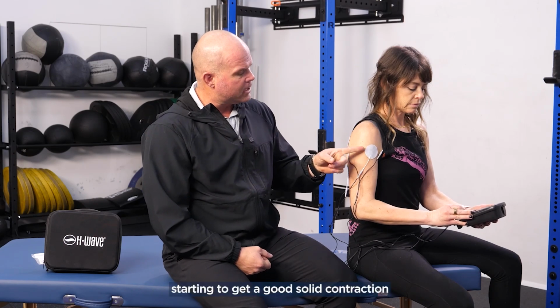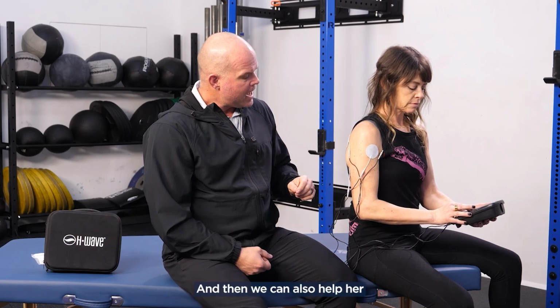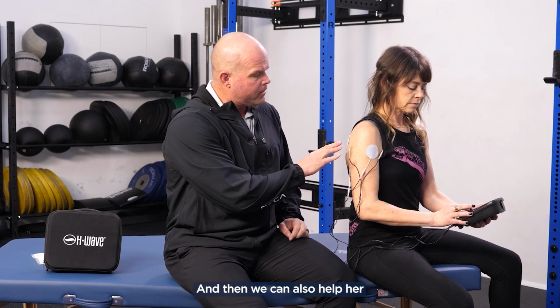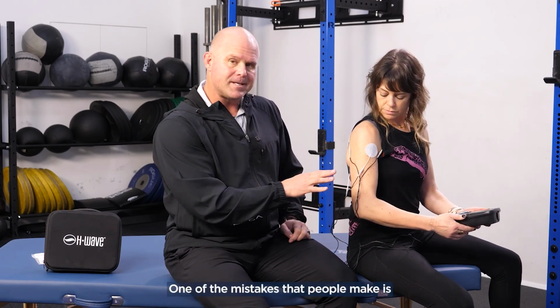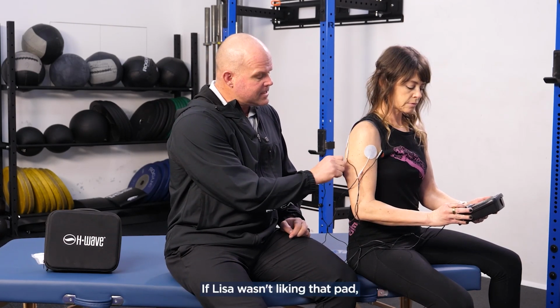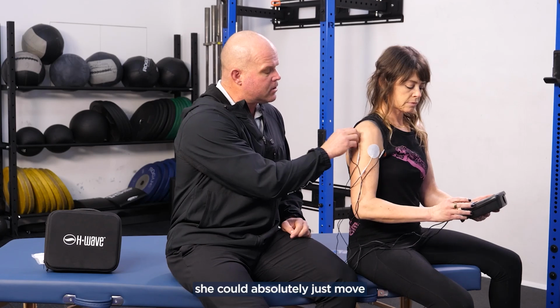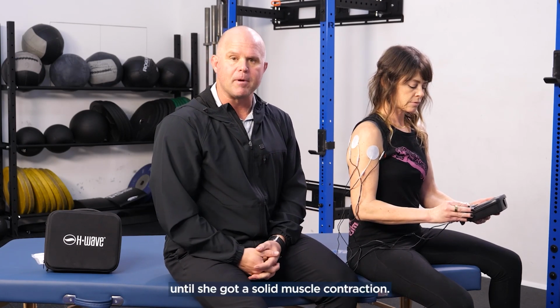So Lisa now is starting to get a good solid contraction in the front of her shoulder, right? She's going to dial this up, and then we can also help her think about where she might move the pads. One of the mistakes that people make is thinking we've got to get pad placement perfect, and we don't. If Lisa wasn't liking that pad, she could absolutely just move that pad in the middle of pumping until she got a solid muscle contraction.